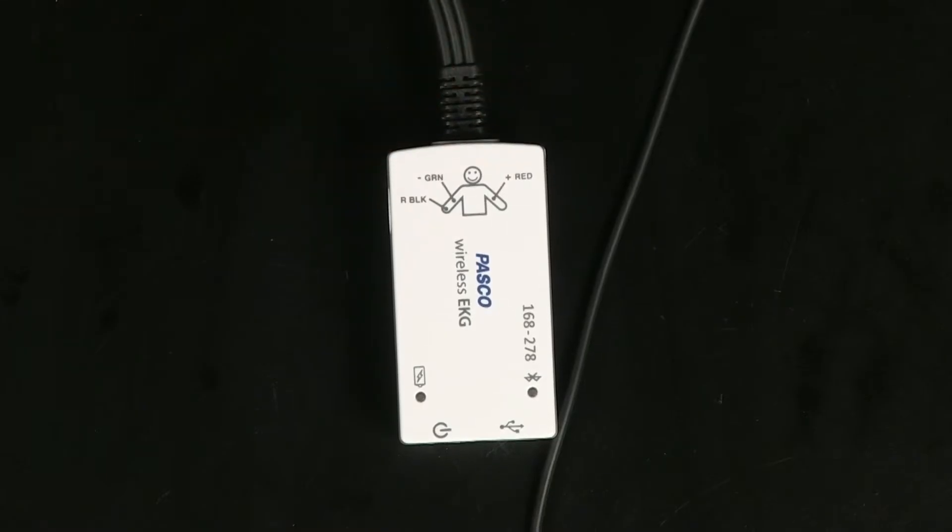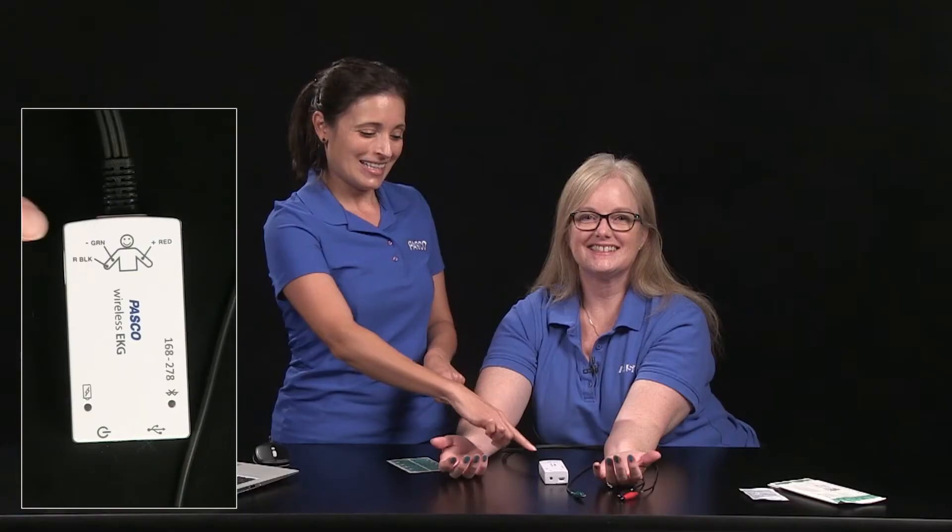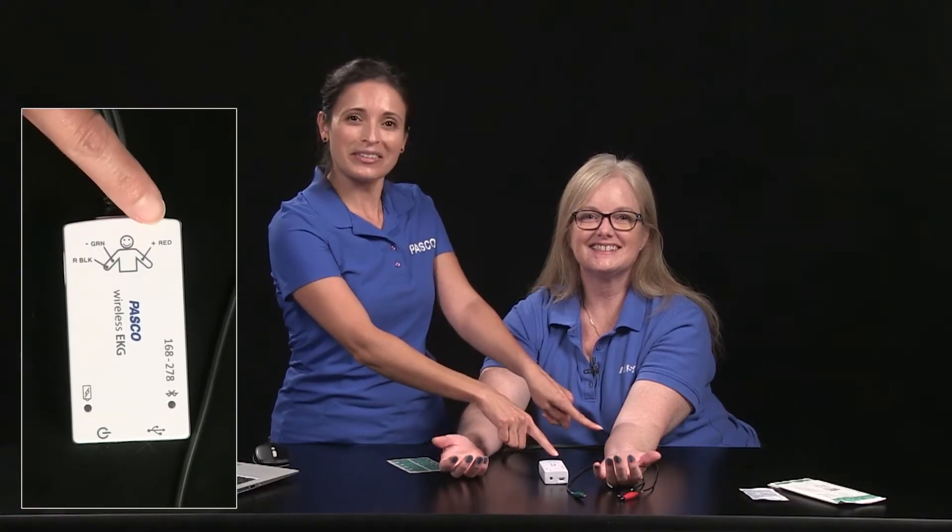The first thing you might notice about the wireless EKG sensor is it has a diagram that helps you correctly place electrodes on the test subject's forearms. Line up the test subject's face with the smiling face on the sensor. This is their right side and this is their left side.